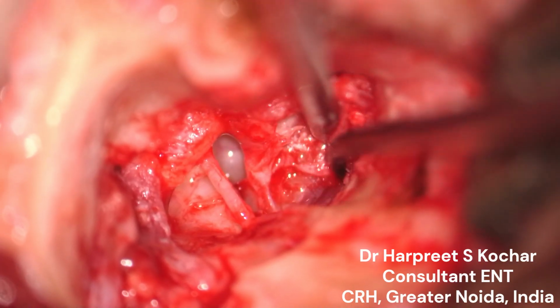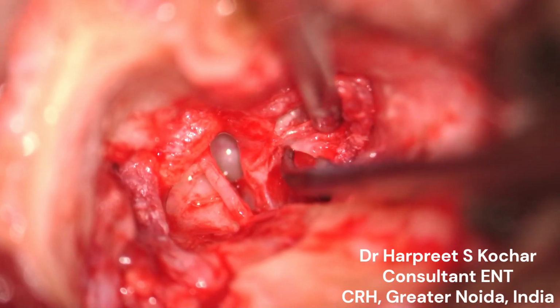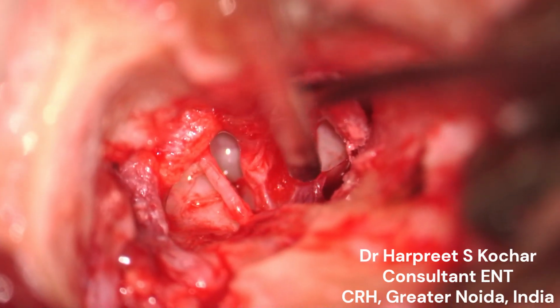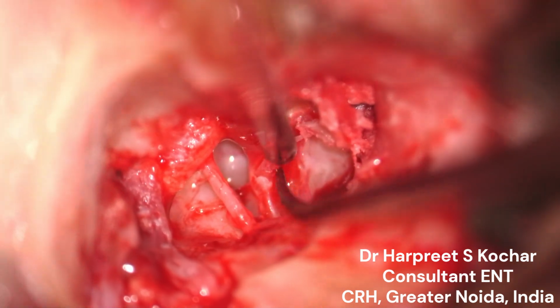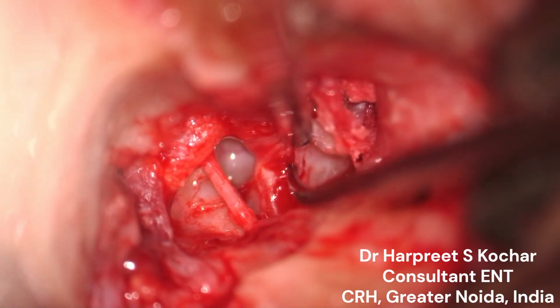Here the epithelium is lifted off from the promontory as well as from the round window niche area. Effort is also made to prevent any damage to the middle ear mucosa that prevents adhesion formation between the new graft which is placed as well as the promontory.